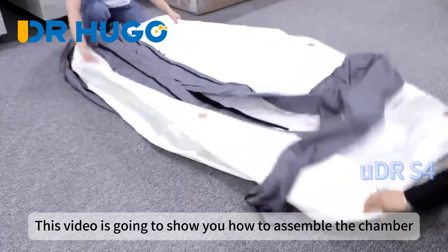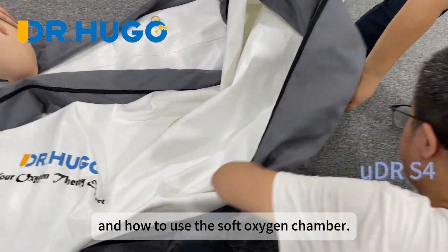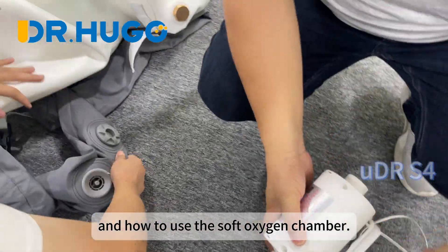Hi everyone! This video is going to show you how to assemble the chamber and how to use the soft oxygen chamber.